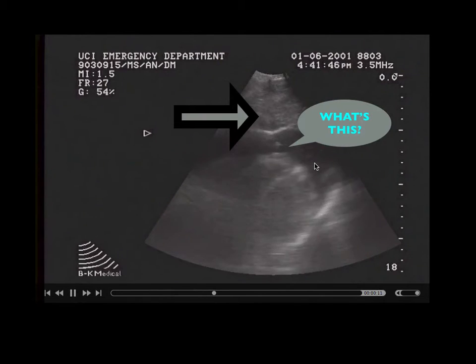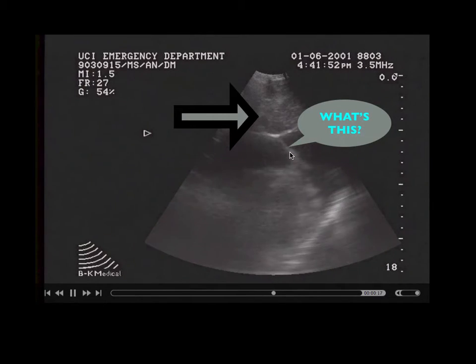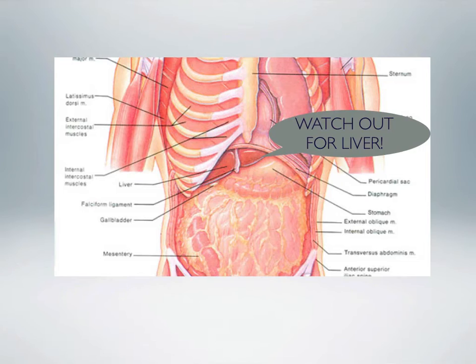Tamponade is readily visible, and we'll explain shortly why there's the catheter, by the way. We'll explain now why it is not typically too crucial that the liver has a needle going through it.